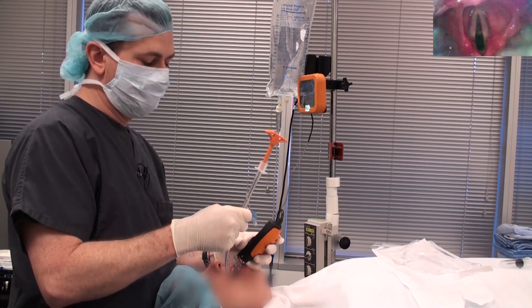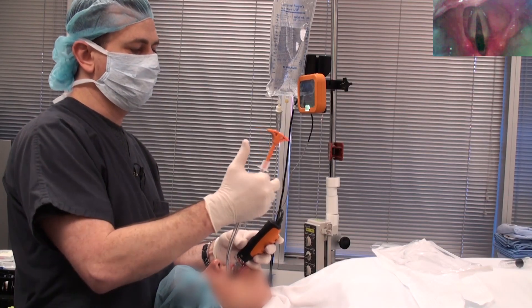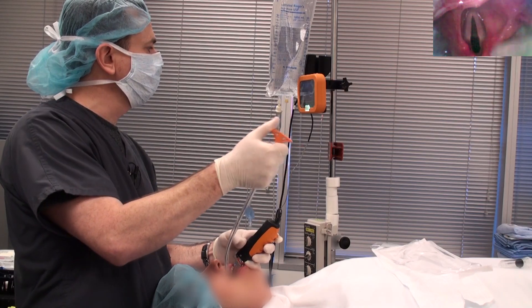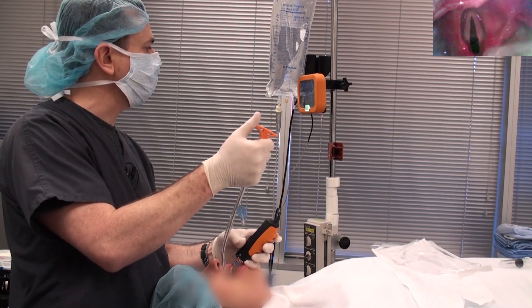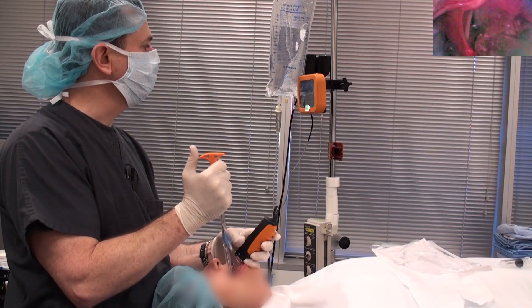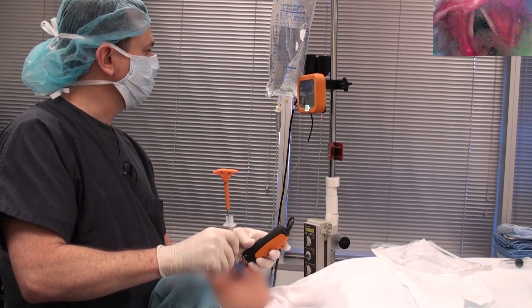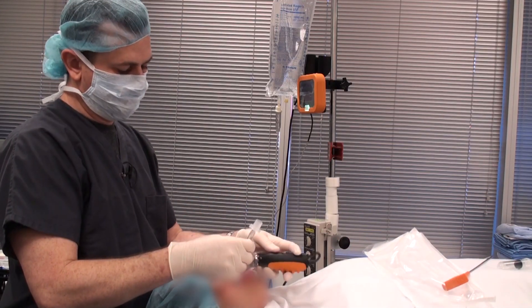Now if you're having trouble advancing the tube, it's probably because you're holding the tube down here in the middle. What you actually want to do is hold it up here at the top, and work this styleted tube kind of like a slot machine. As you pull back, it raises the tip of the endotracheal tube, so you can advance it through the cords, pull the stylet back a little bit, finish advancing the tube, and you're done. Nice and easy.